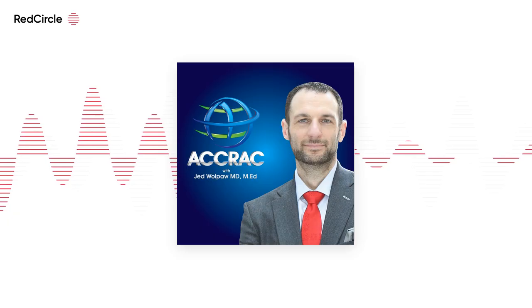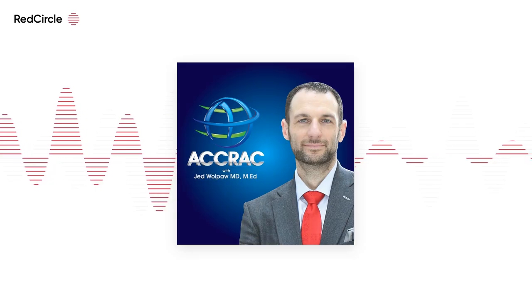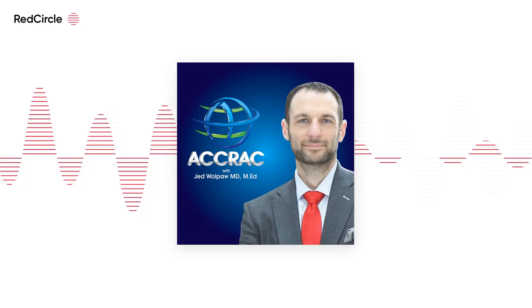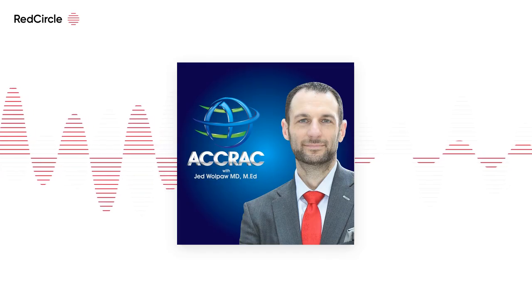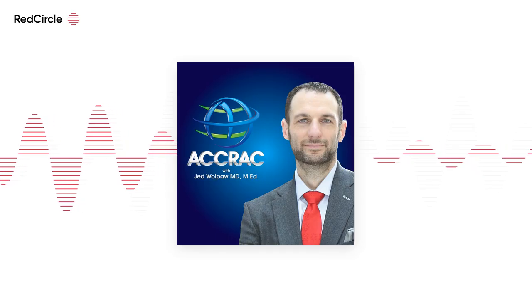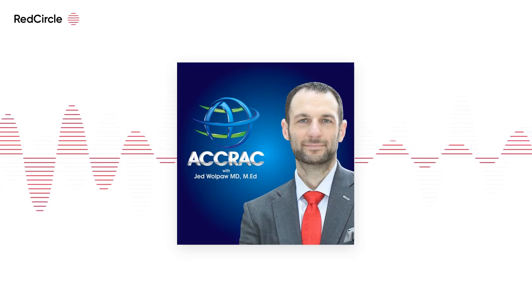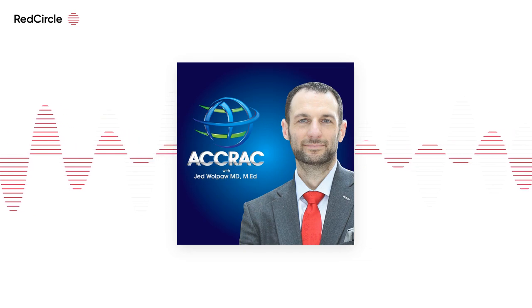Yeah, recruitment takes more time. De-recruitment is definitely much faster. I believe studies have shown 1 to 2 minutes, and like 90% of the de-recruitment that's going to happen is going to happen. Now, that's assuming you're not going to move the patient all of a sudden. So if you do this maneuver and then nursing comes in, does a full bed bath and flipping the patient all over, this is obviously going to completely change where your optimal PEEP might be, particularly when position changes. But in all, just to get back to the decremental PEEP trial, that was typically how it was done.